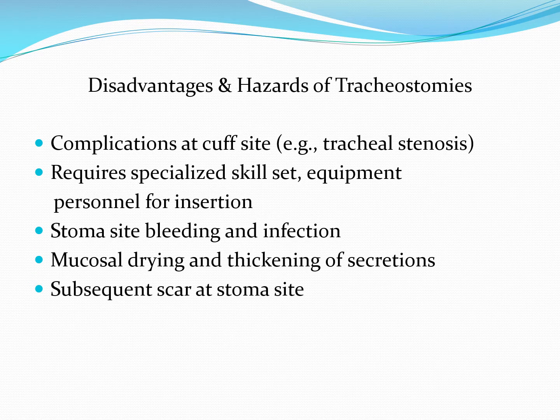Just as there's advantages and indications, there's also disadvantages and hazards. Some of those disadvantages and hazards relate to complications at the cuff site, including tracheal stenosis, particularly for cuffs that have been overinflated for a long period of time. They can impose that pressure on the delicate tracheal wall, tracheal mucosa, and cause a reduction in blood flow to it, initially causing some softening, but eventually can cause some scarring to happen there.